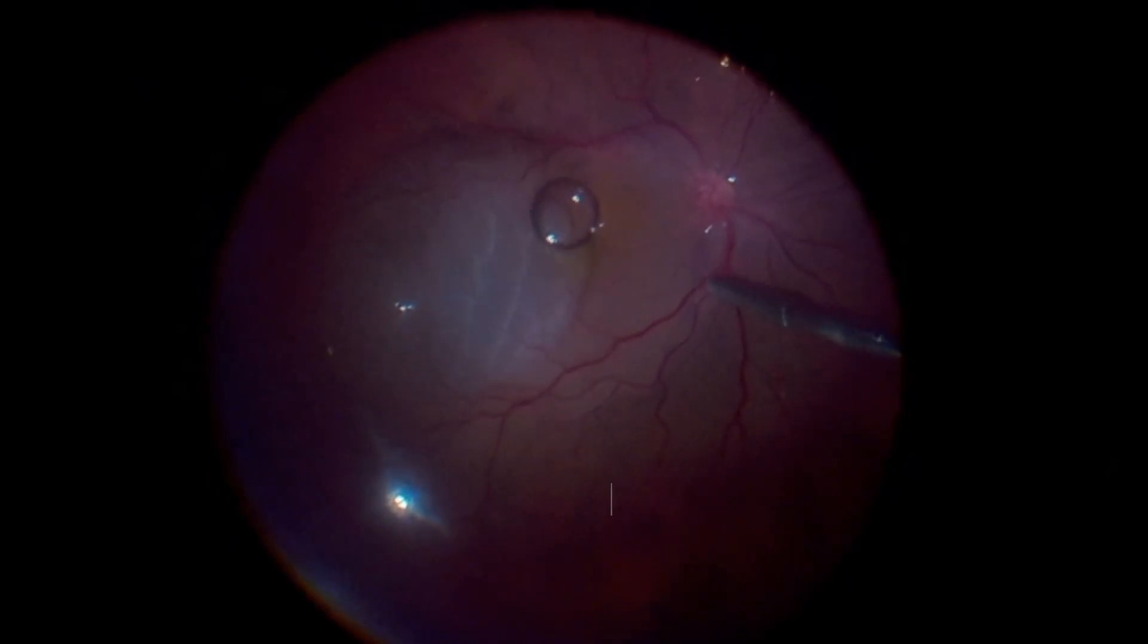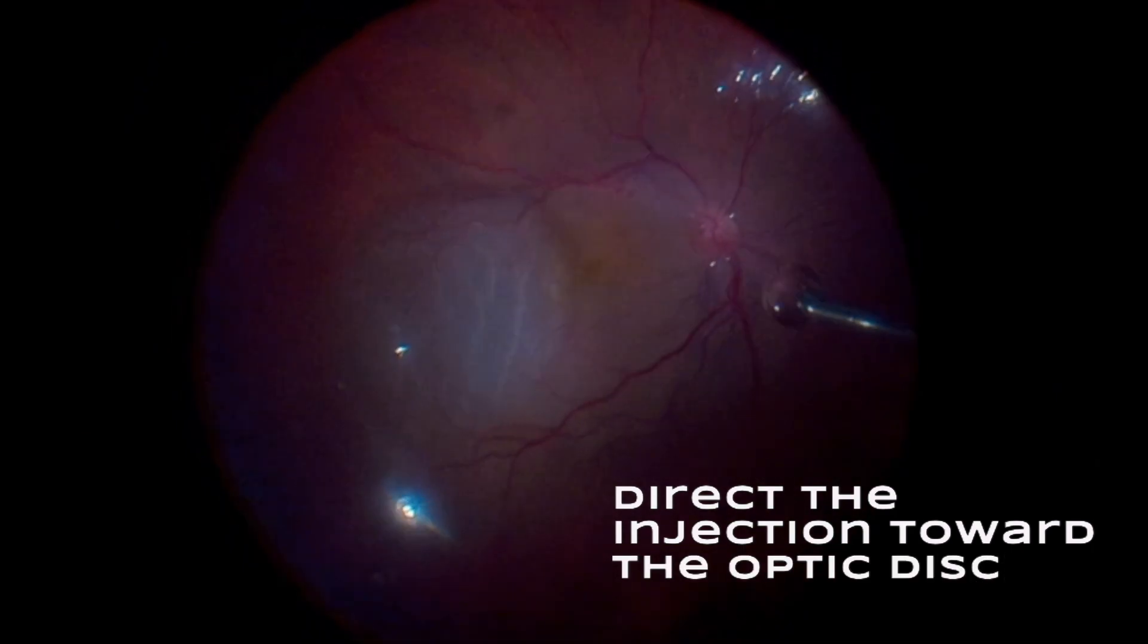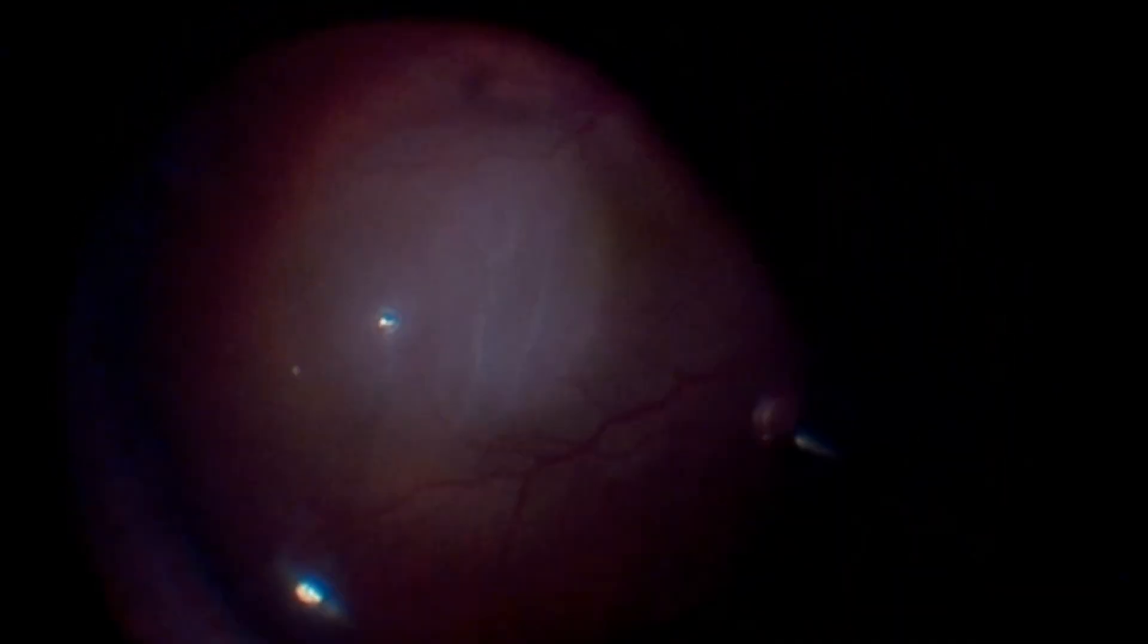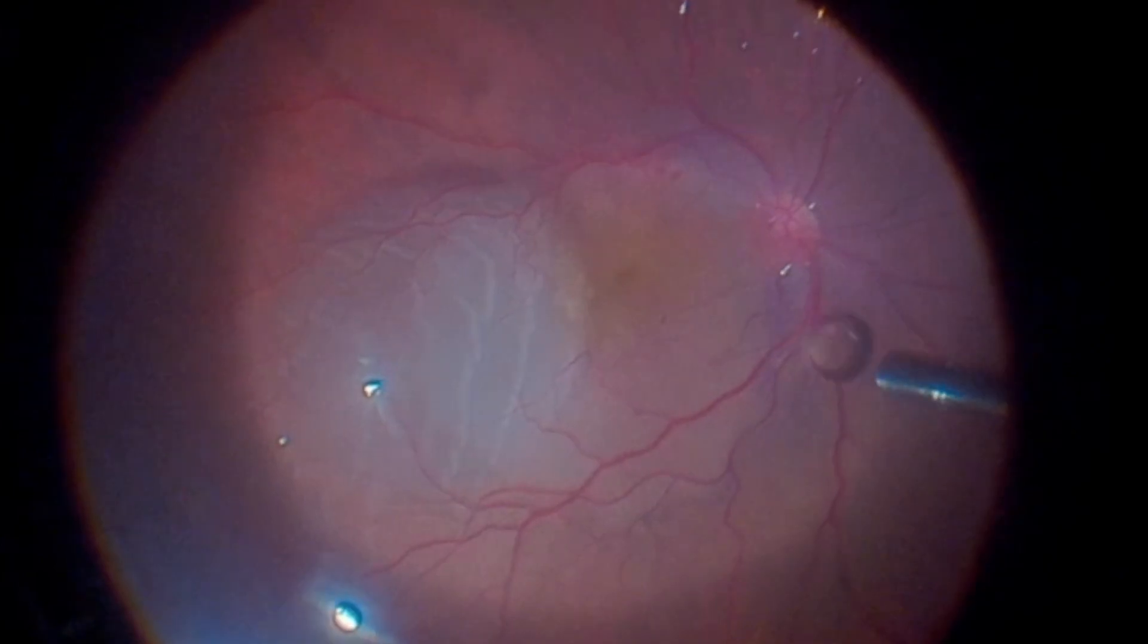It is recommended that the injection be directed toward the optic nerve instead of aiming at the retina. When the flow is directed toward the retina, direct migration of the substance to the subretinal space may occur.